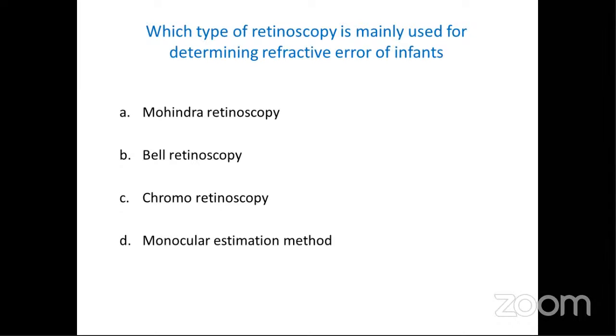It is believed, and also seen practically, that when there is no object visible, the accommodation will be in a relaxed state. The question here is why nothing will be visible? The retinoscope light will be visible to the baby. There are two forms of vision: one is form vision, another is light vision. Light vision is supposed not to affect the accommodation. Because of that reason, the child will only see the light. He will not be able to see the retinoscope. So looking only at the light does not cause accommodation.